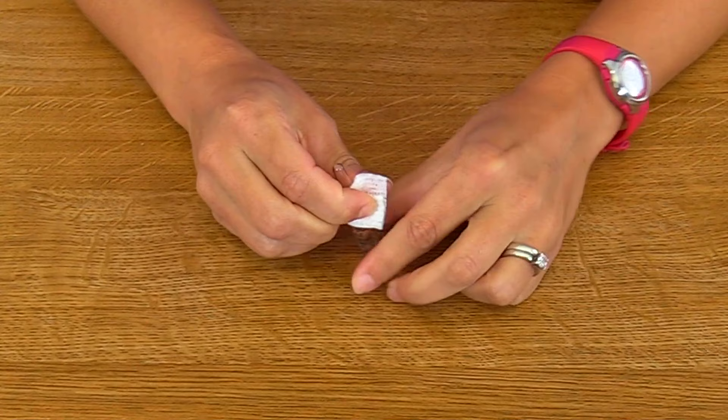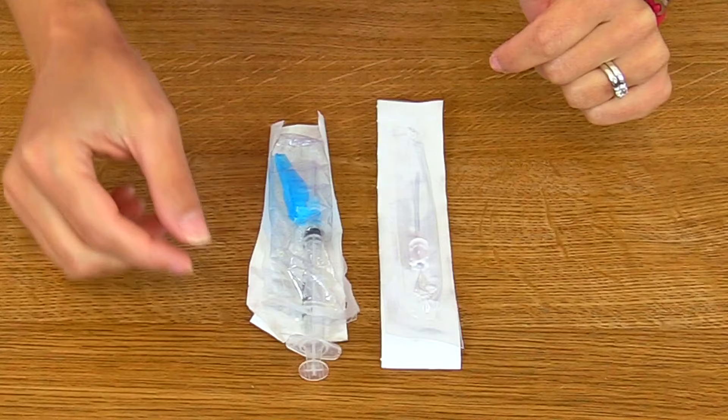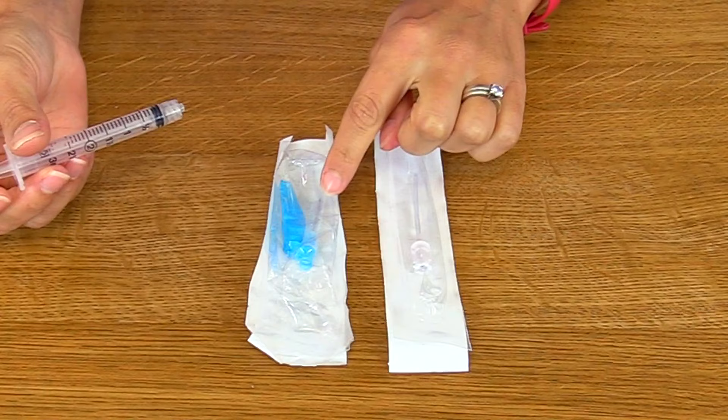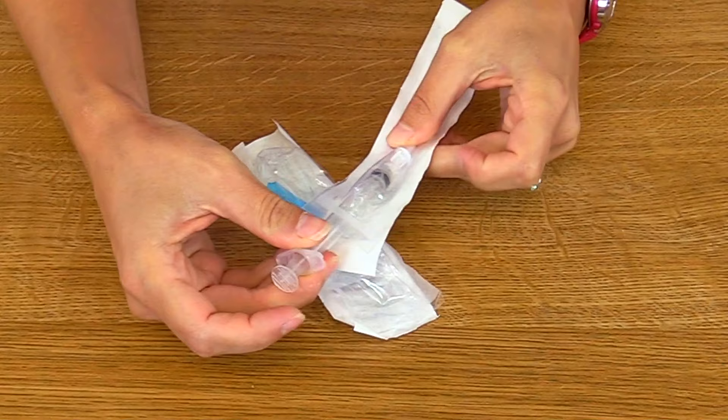While we're letting our ampule dry, we're going to connect our syringe to our filter straw. We've already opened our packaging, so we're going to unscrew the syringe from its original needleless device and leave it in the packaging — because we're actually going to use that device to administer the medication. Remember, you don't administer with the filter straw. Take the syringe and screw it onto the filter straw, and leave it in the packaging until we're ready to withdraw the medication.